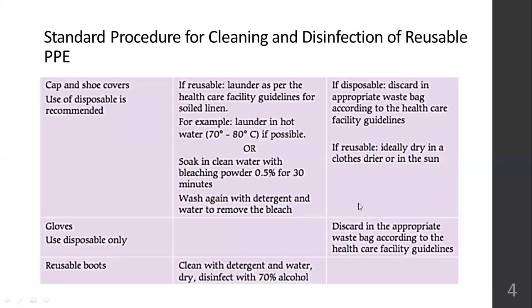Okay, gloves, you will never reprocess it. Gloves will always be disposed. Okay, boots if you're using, that is reusable. Rubber boots, okay, detergent water or disinfect with spirit and dry it.